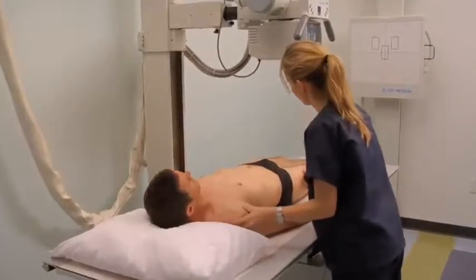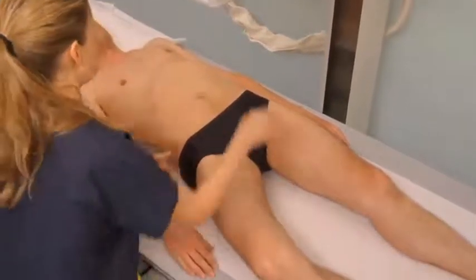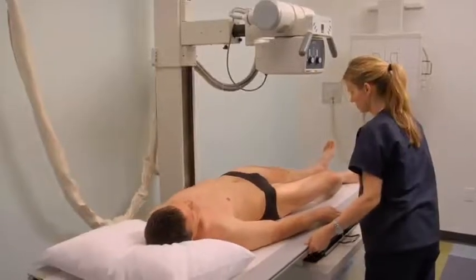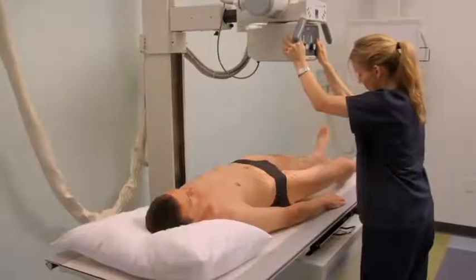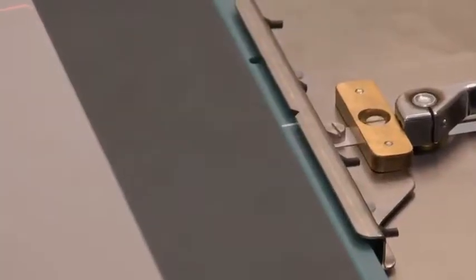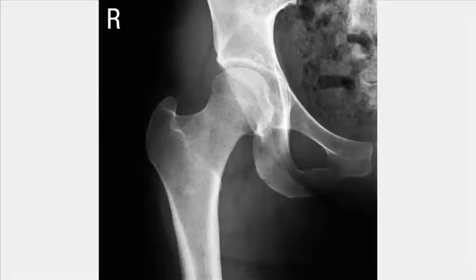To obtain a unilateral frog leg hip projection, flex the leg of the affected side and gently abduct the femur to 45 degrees from vertical. Align the hip joint to the center of the image receptor; the thigh and knee can be supported with a sponge. Position the central ray to the neck of the femur and line up the image receptor with the central ray. Collimate, expose, and process the cassette as for the earlier projections. Analyze the images obtained.